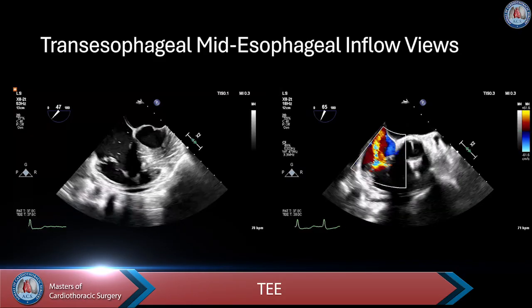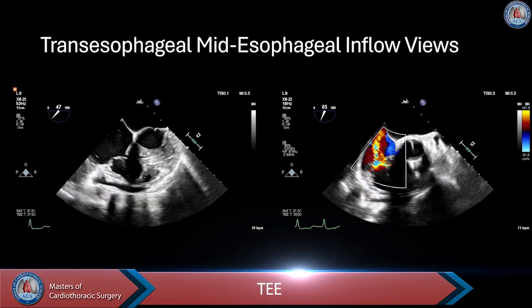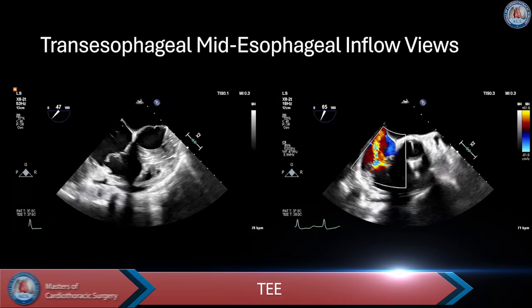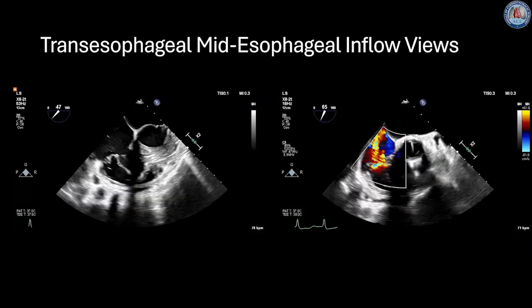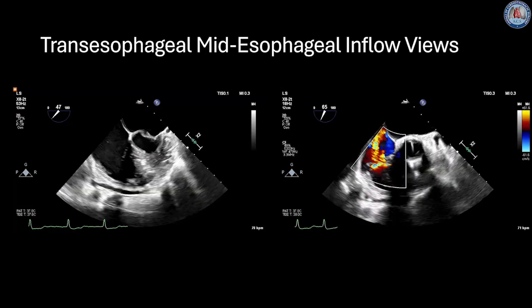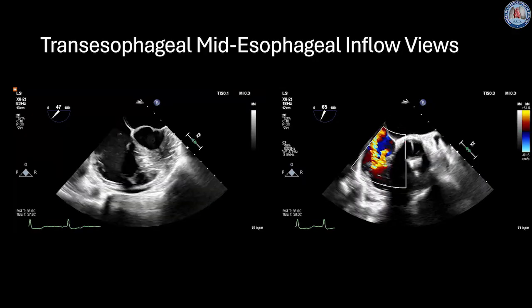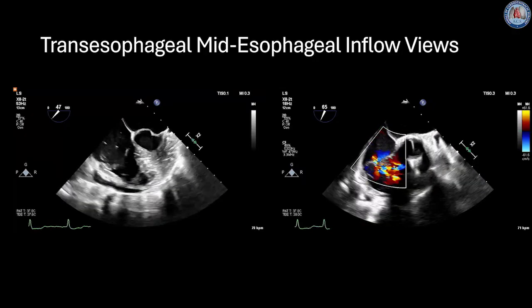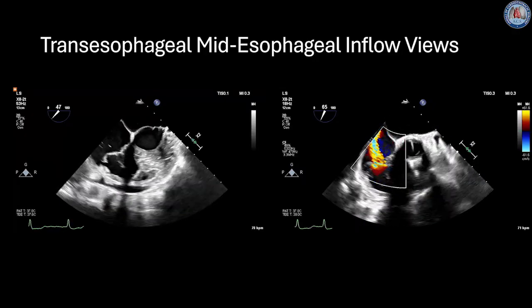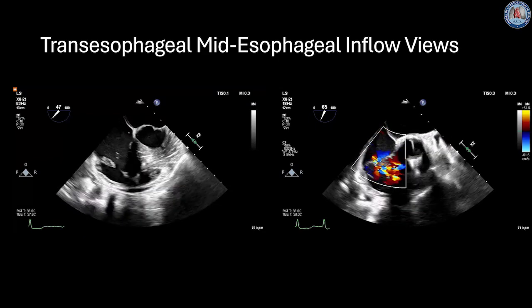Comprehensive outpatient pre-procedural planning was performed using transesophageal echocardiography to define tricuspid valve anatomy and guide procedural strategy. Shown here were the initial RV inflow views with and without color Doppler, which demonstrated severe tricuspid regurgitant, or TR, jets with one main jet near the posterior septal plane and another smaller TR jet more anteriorly.